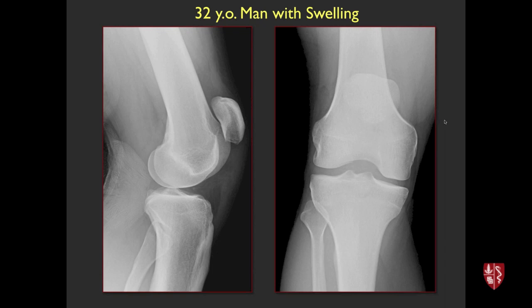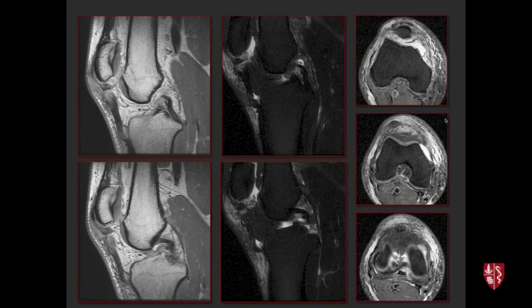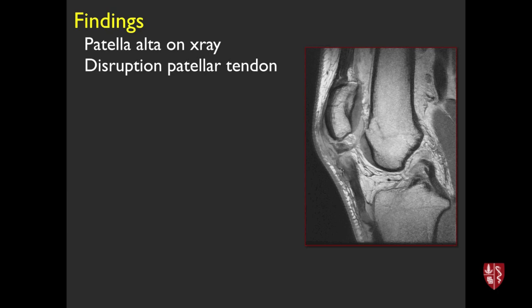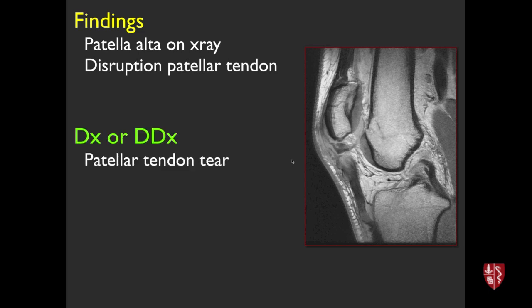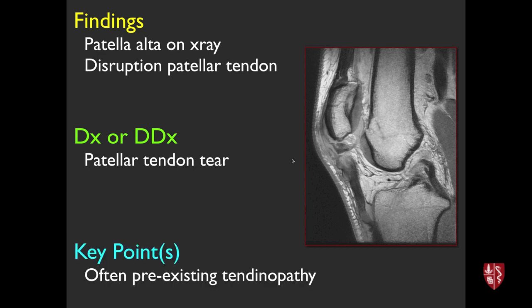32-year-old man with knee swelling. Radiograph showed patella alta. MRI shows disruption of the patellar tendon at the proximal portion — a high-grade, probably complete patellar tendon tear, as evidenced by the elevated patella. These tend to occur in patients with pre-existing proximal patellar tendinopathy or jumper's knee, unless it's a high-energy injury.